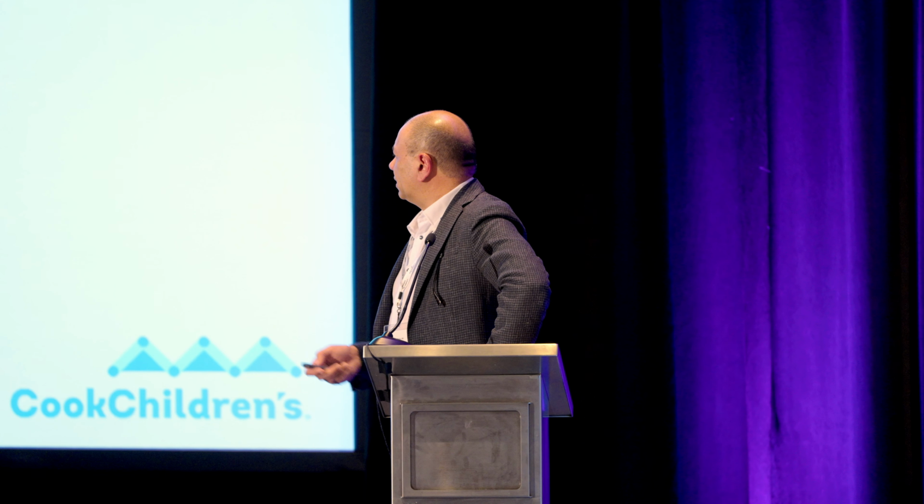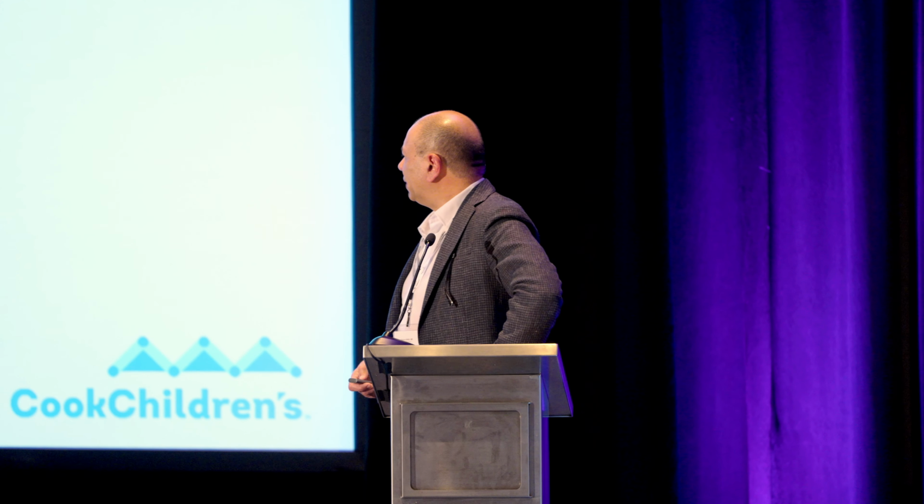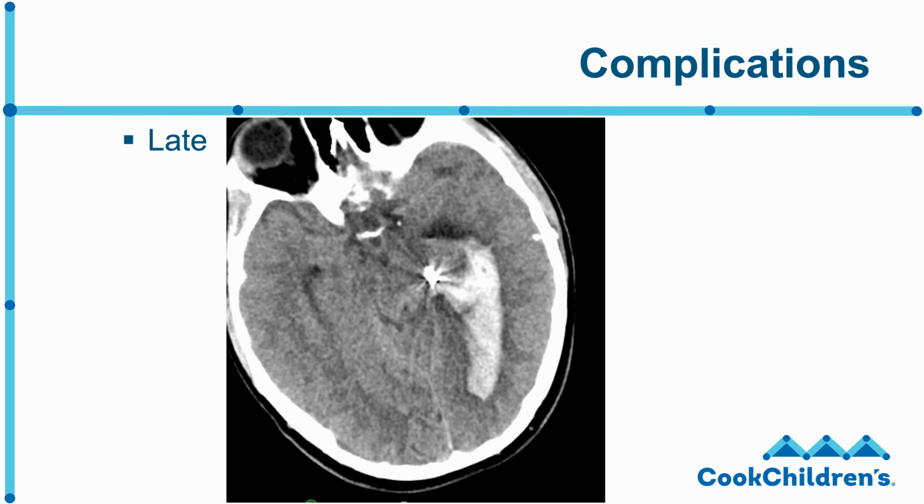So again, emphasizing being careful with the over and under sampling. This is a slide of a patient who, I call it a late, but this was 3 days late intraventricular hemorrhage after the patient went home. So all these complications are a possibility. And I think when we approach these patients with stereo EEG or any invasive procedure, you have to have a counseling with the family about what can be a problem. I'm done with my talk.